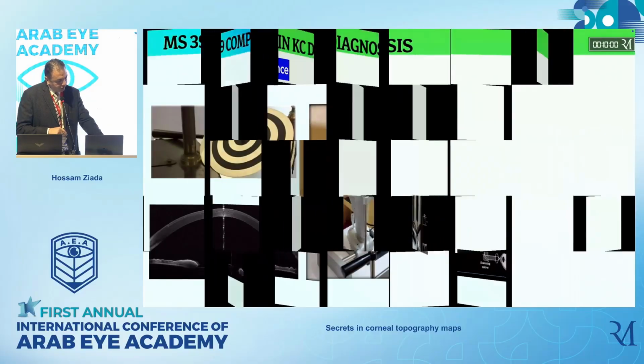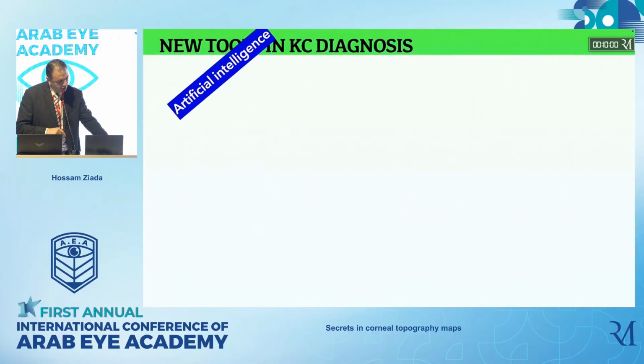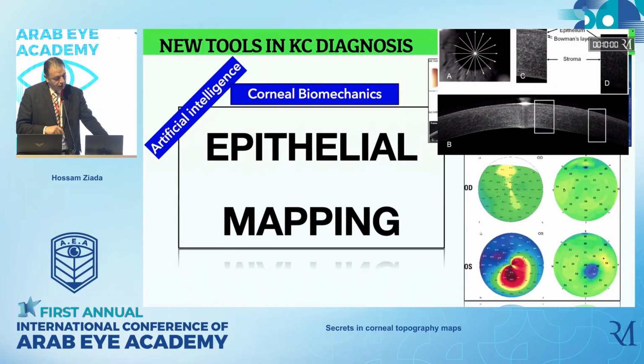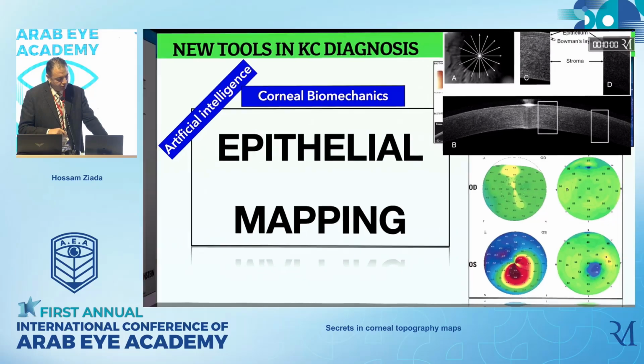It's complementary, as I said, with the new tools in the keratoconus diagnosis, artificial intelligence, the corneal biomechanics, and also the epithelial mapping.